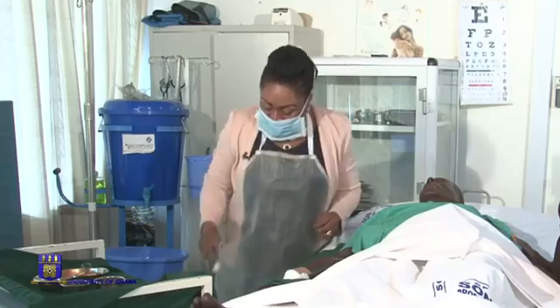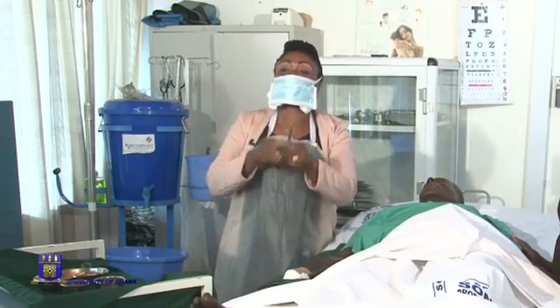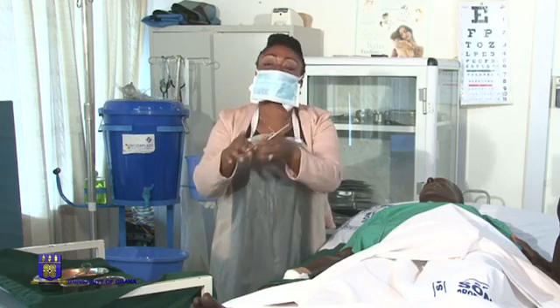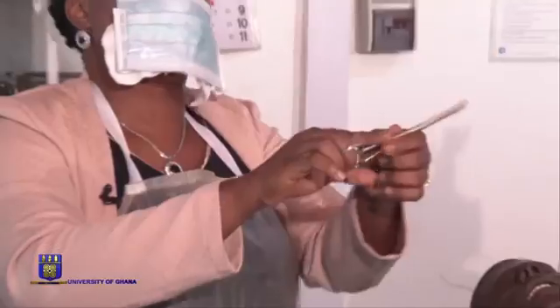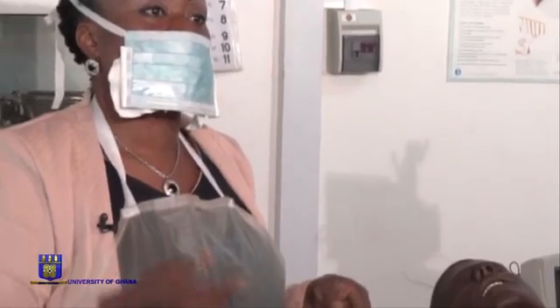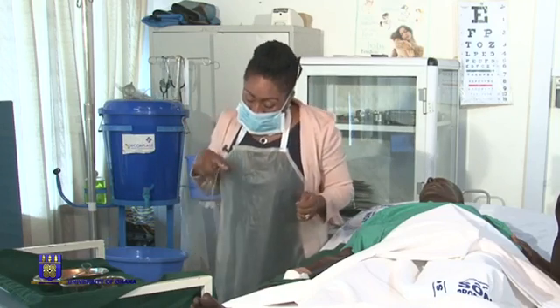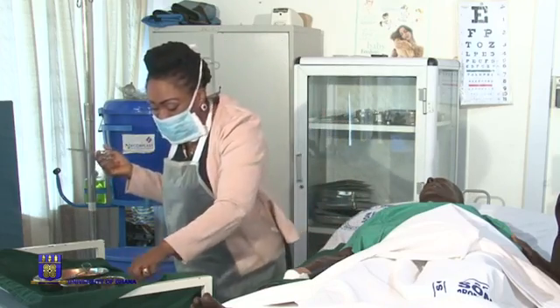My wound is still dirty. There are still discharges. If you want to open, sometimes students struggle. They have to use their two hands to press before they open the forceps. It is very simple. With your middle finger and the thumb in the two holes, you place your forefinger here to help with the opening and closing. When you are opening, you just lift and it opens. Don't struggle. You just give it a little shake and the swab is in the receptacle.